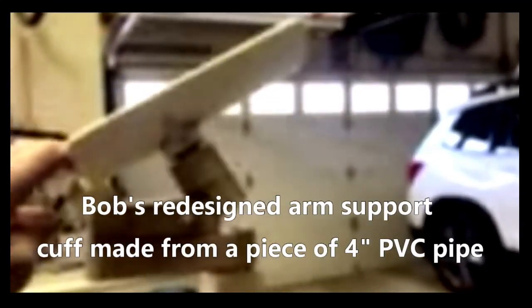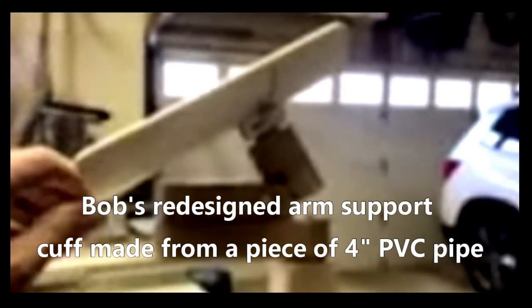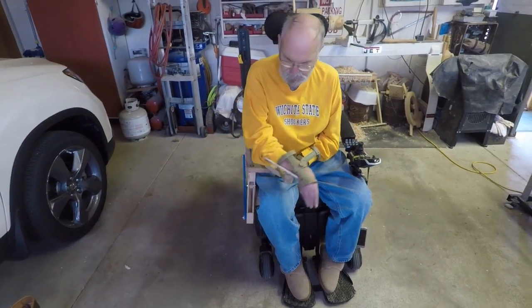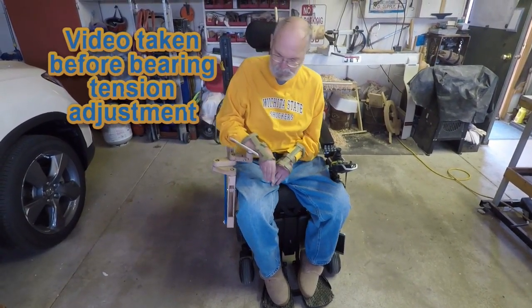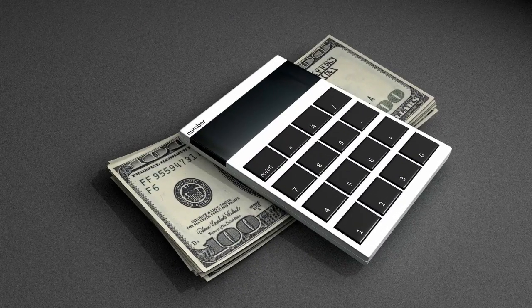Bob and I agreed that more fore and aft tilt was required on a longer arm support. So a couple days later, I received a text message with the updated arm support cuff and tilting mechanism. It was now time for another trip to Bob's shop and another prototype review. As I attempted to move the three articulating upper links, I realized that I could reach about 15 inches further in front of me, to the left and to the right with my right hand, compared to without this exoskeleton. Prototype test number two — another success.